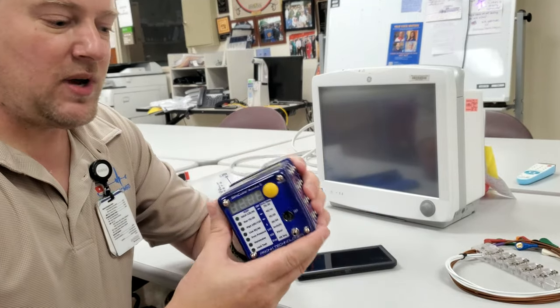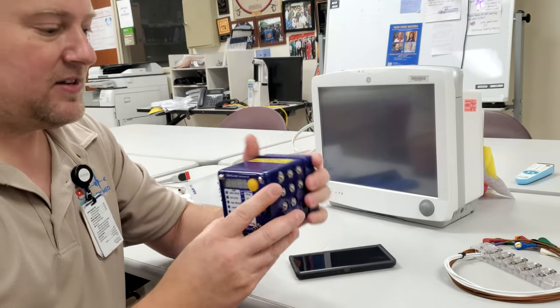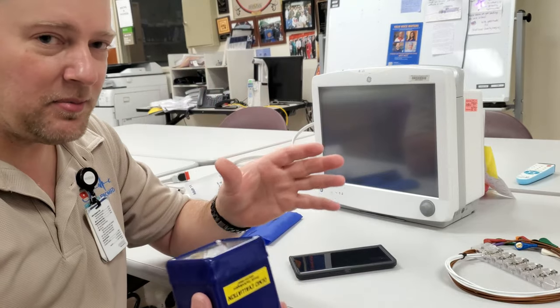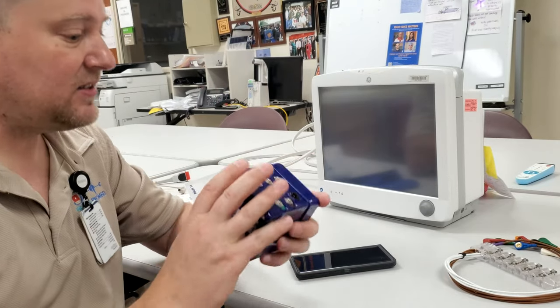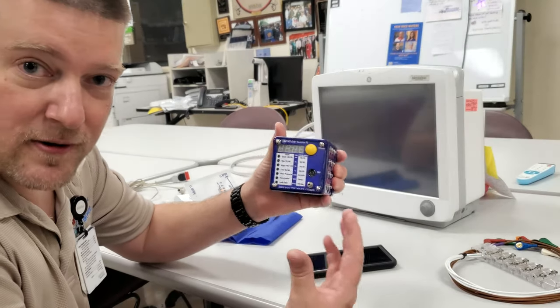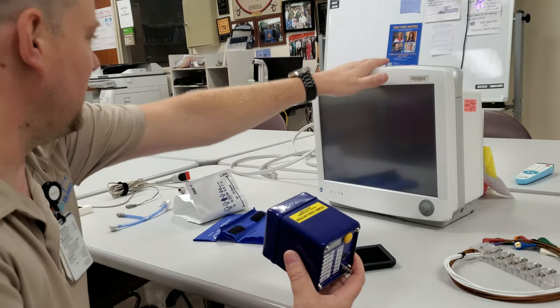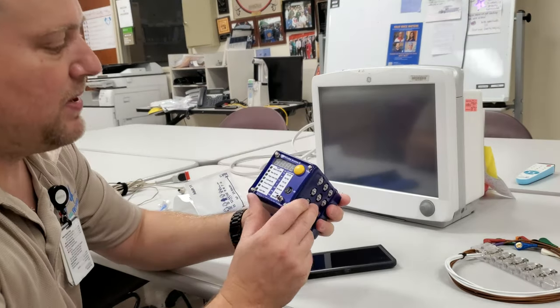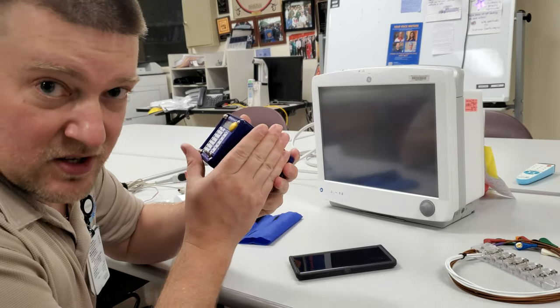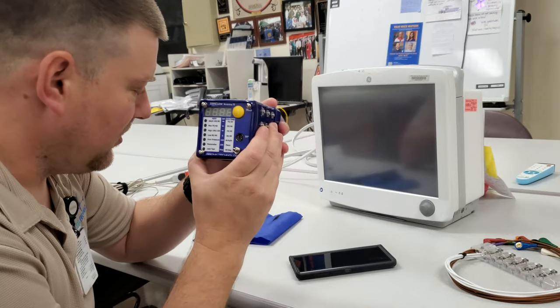Today I'm going to introduce you guys to the SimCube. This is a fantastic little device produced by Pronk Technologies. You guys probably already are aware that it exists, but I am here to share with you some of its extra features. I'm going to use a generic GE monitor. We're going to go over the NIBP, the invasive blood pressure, some of the ECG features. It does quite a bit of stuff for this little cube.